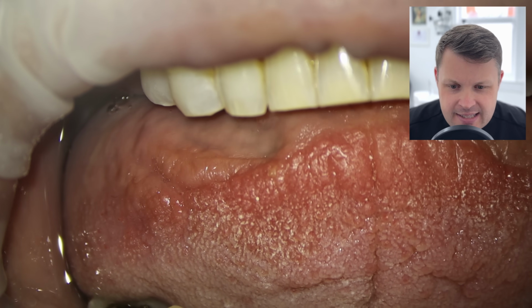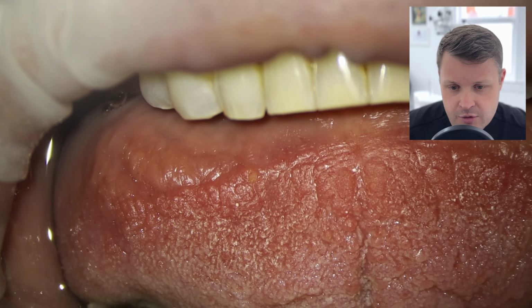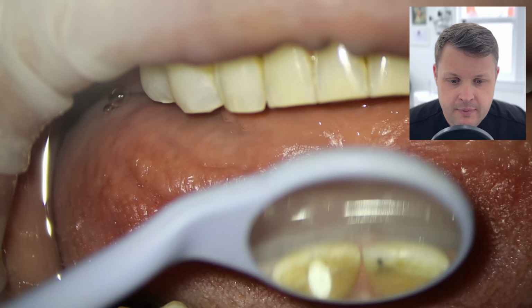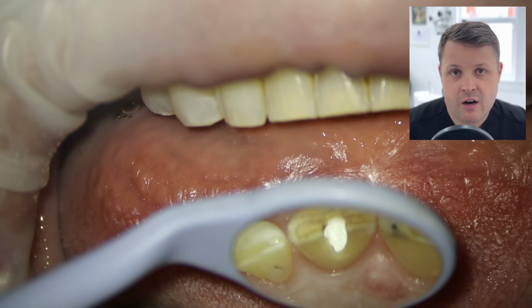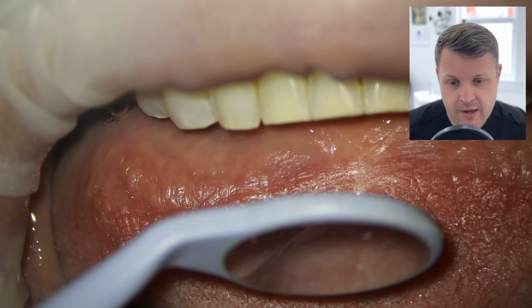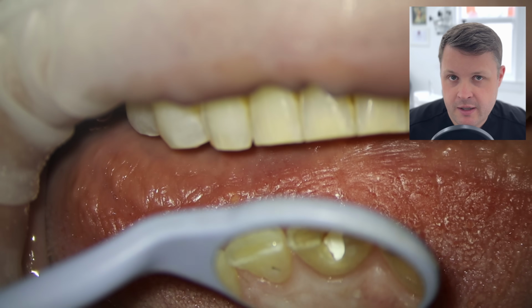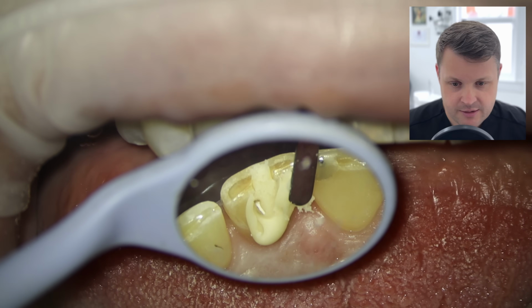And as I was editing this tooth, I started to reflect on this, and I thought to myself, well, I was basically drilling into dark tooth tissue. So that's one thing I'm thinking to myself, was that right? I didn't really take a proper working length radiograph or a proper working length X-ray.